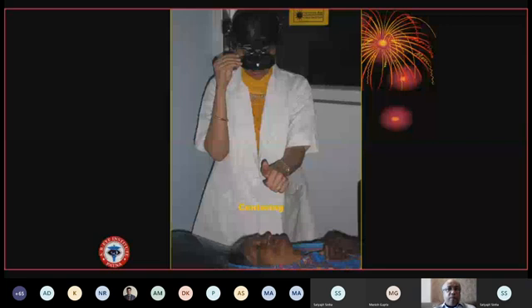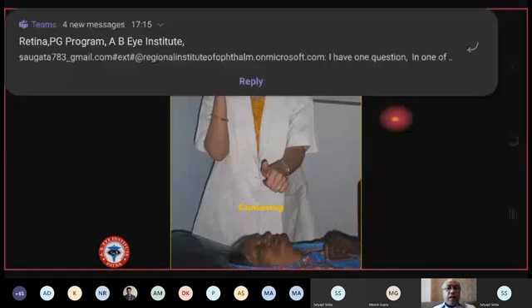Walk away a little bit. It should become smaller as you walk away and larger as you come close to the wall. And at the same time, exactly what Dr. Pooja is doing, put your thumb up at your eye level, far away from you, and look at the wall. Make sure that when you close the right eye and left eye alternately, you can see the thumb centered over there. It shouldn't be moving too much. Then you know that both your IPD settings are fine and the image on the wall is fine, and you will be able to see a patient properly. Just jamming the instrument onto your head and immediately taking the lens is not a great idea.